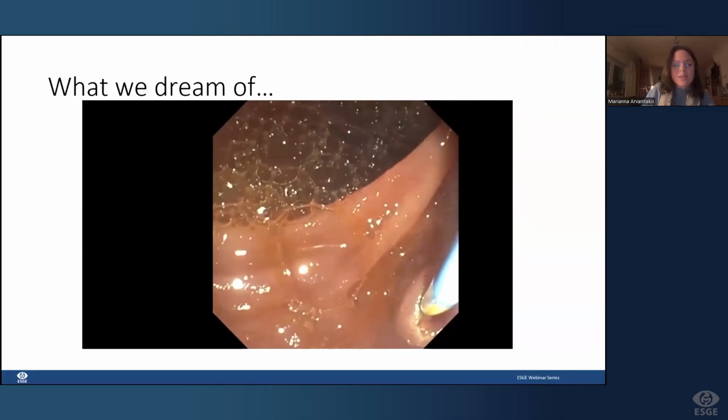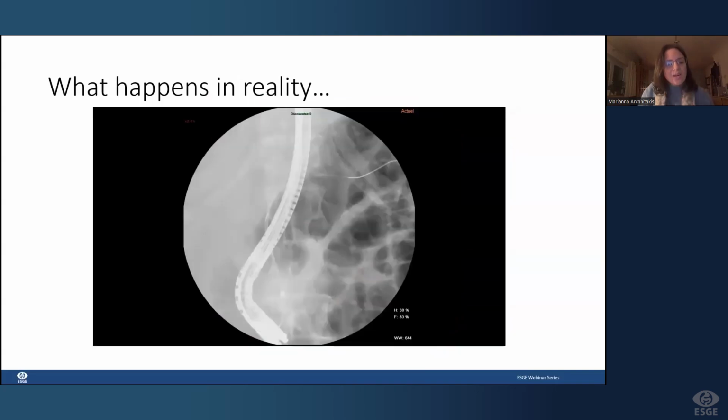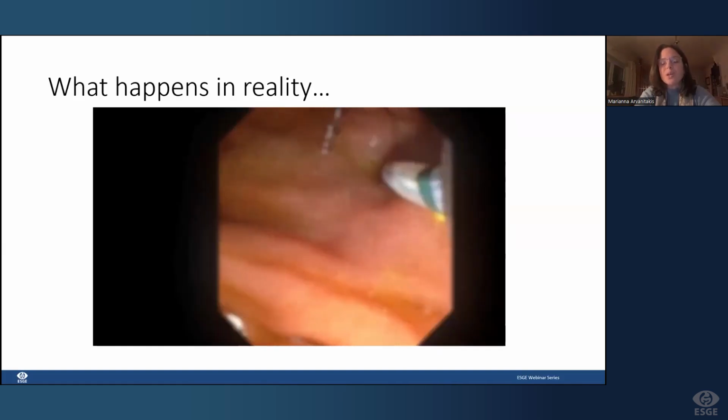So this is really the perfect cannulation, because we have the perfect conditions, but of course, it's not always the case. And here, sometimes our guide wire will go into the main pancreatic duct, as we see here in this X-ray picture. And then in this case, we will maybe consider doing a double guide wire technique.